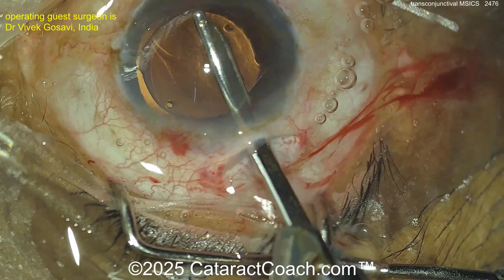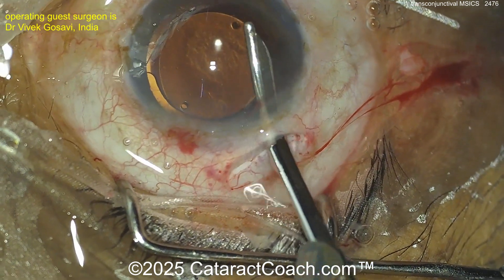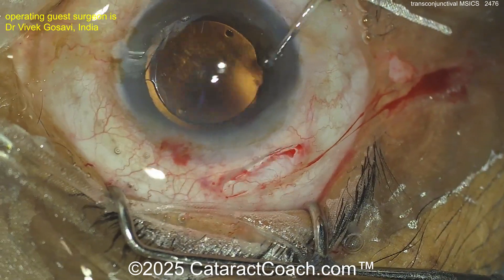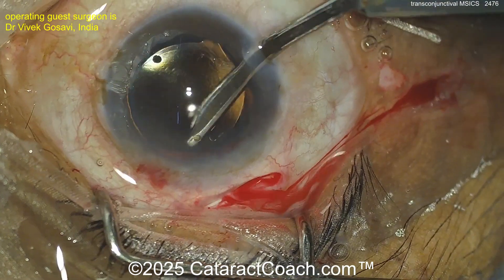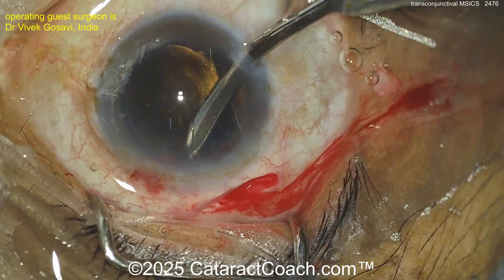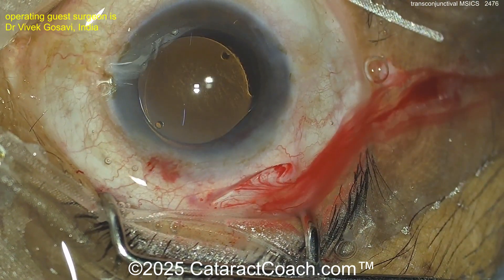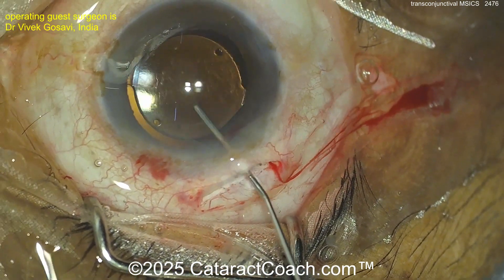Now finishing up the case — the question is, do you put a suture in? I'm a little more conservative; I'd just put one in. You can put in a Vicryl — you don't even have to remove it later, it'll fall out on its own. I'd put at least one Vicryl through the scleral incision, maybe even a nylon if you want. I'd also be tempted to pull the conjunctiva down and maybe cauterize it in place, or inject antibiotic and steroid just to puff it up and cover that area.